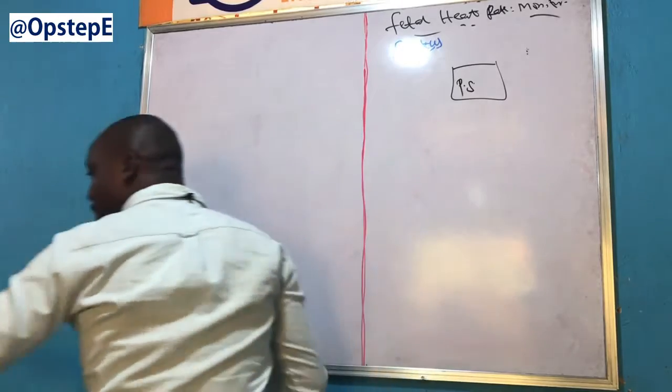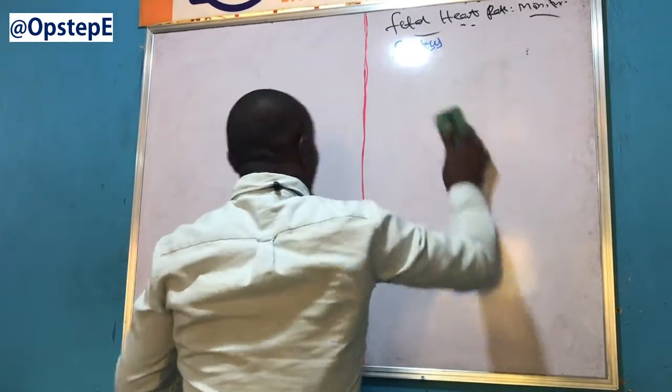let me do that now. Let me be like the students.